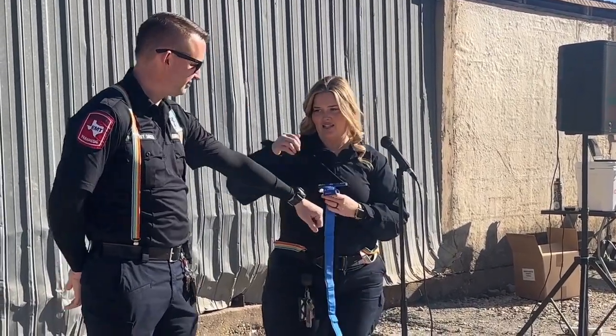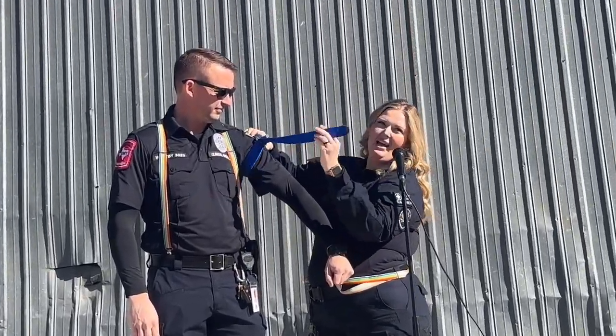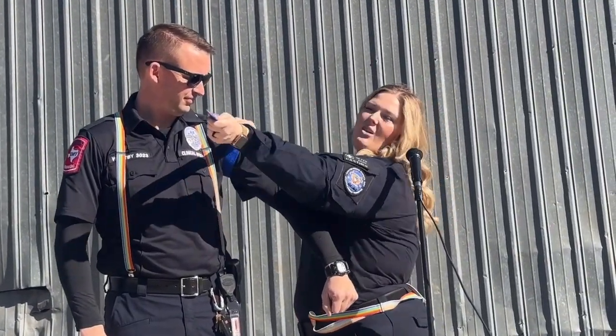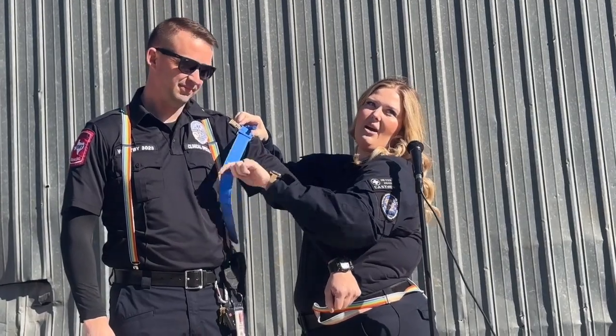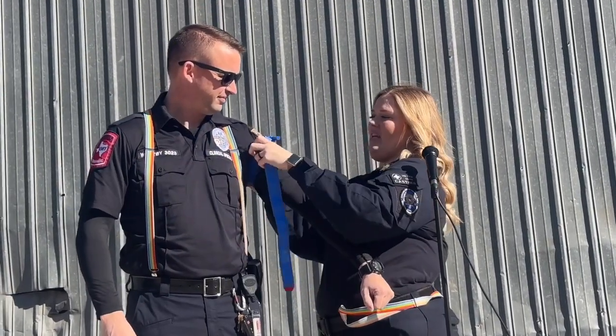You wrap it around the extremity that is hemorrhaging. The way that I teach people is red goes towards the heart — you want that red tab being pulled into the center of their chest towards their heart. And you want it high and you want it tight.